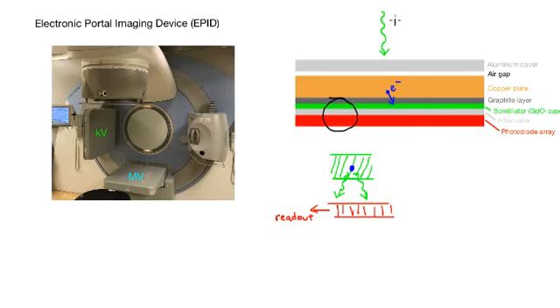So if we look back here for how X-ray images are generated, there are two important sources of that. One is the number of photons, N photons coming in per pixel, and that's going to impact the noise. Because this is a random counting process, you've got N photons on average coming into that pixel, but how many you observe is a random process. Let me describe the mathematics behind that. We're going to have to look at the Poisson distribution.